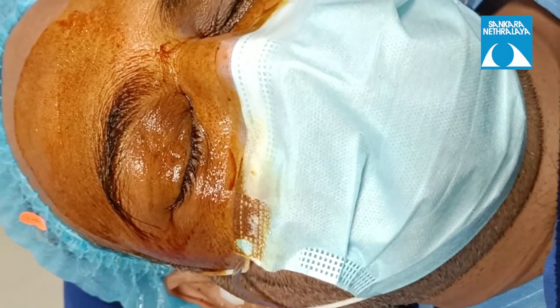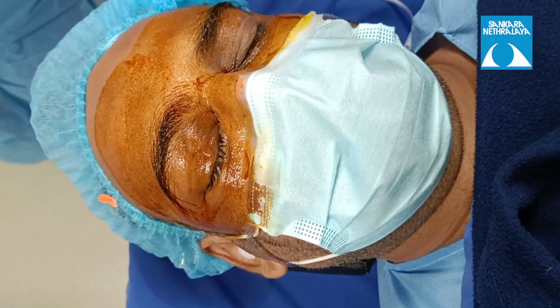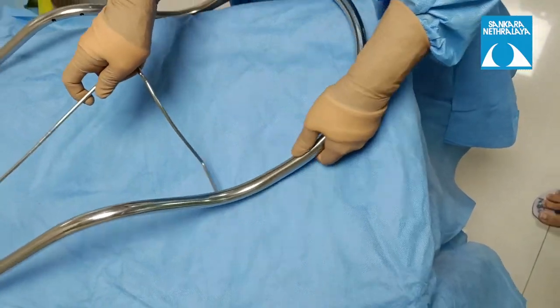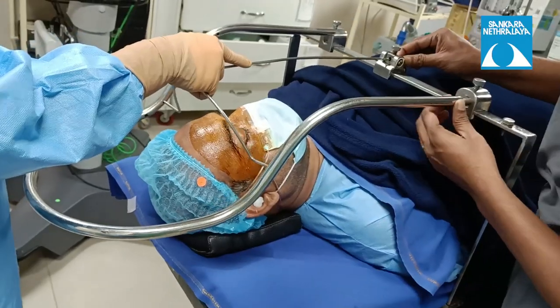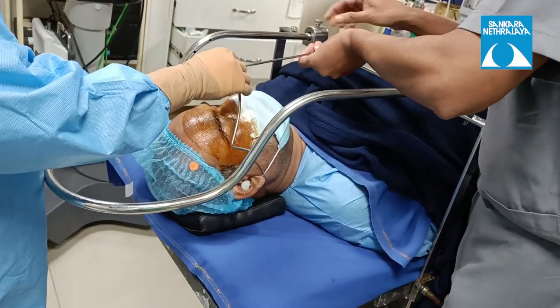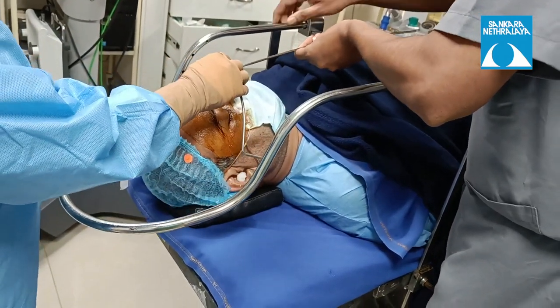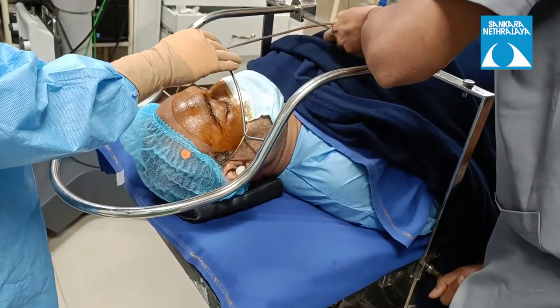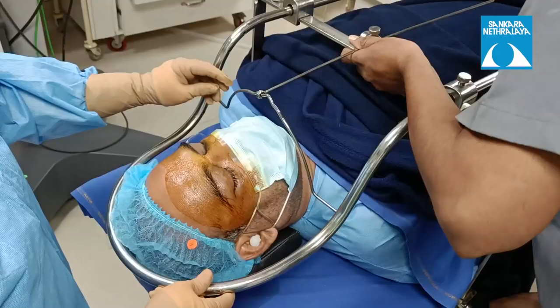After cleaning with the last gauze piece, the iodine solution on the skin is left to dry on its own. Once the iodine solution completely dries up, we proceed with placement of the surrounding frame and central stand, which should be adjusted to the height of the patient's ears. This provides good hand support for the surgeon and also creates a gutter for the waste.